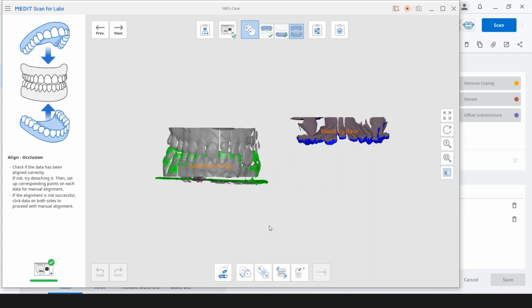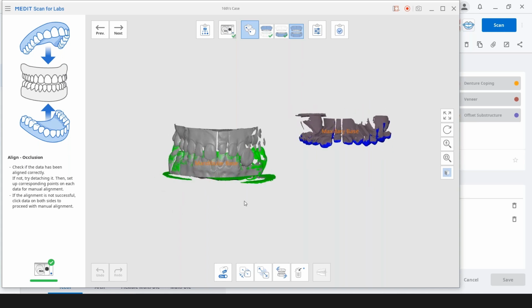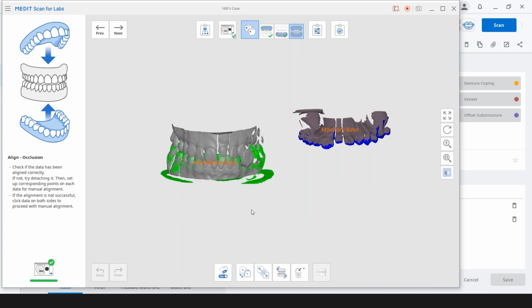Like say you're doing a clear aligner and you want to open it up 1.5 millimeters. There's a sliding scale down here in the icons, and you set it at 1.5 and hit apply, and it'll open it up. That way you have room to design a clear aligner between the two cases. You could set it at any increment, or use a slider bar. Unfortunately, all my cases I did today, nothing happened like that. So I'll have to look into that.